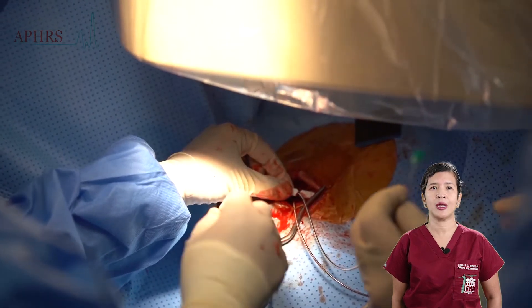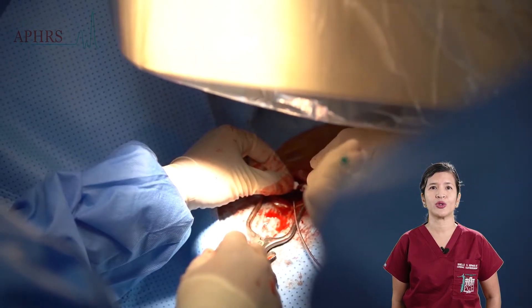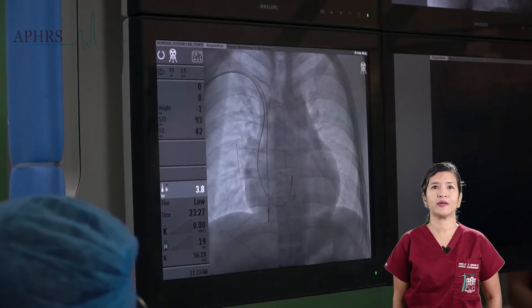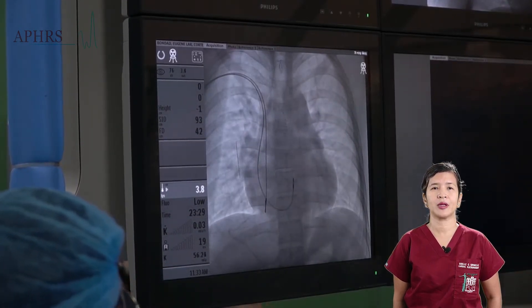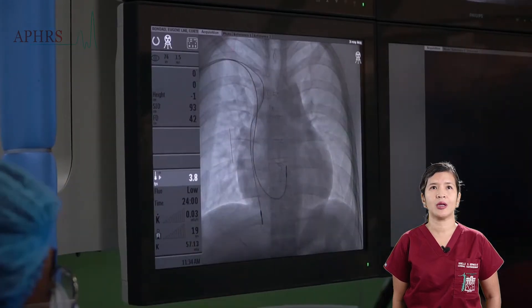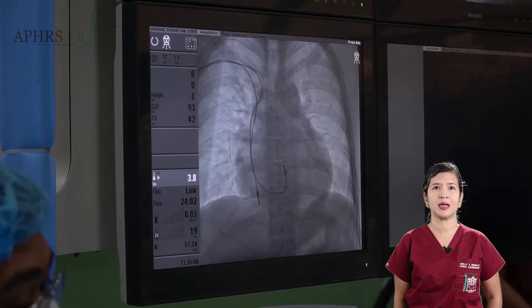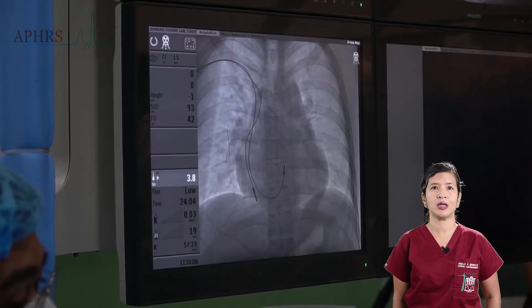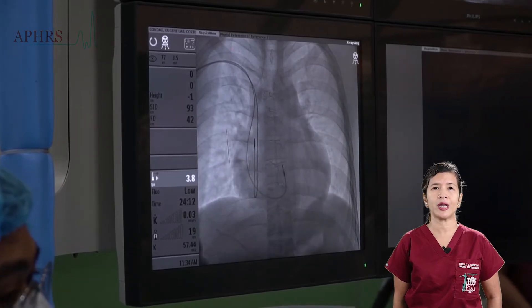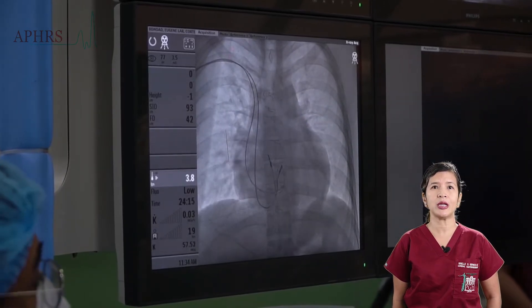Alternatively, a valve sheath may be used. The RA lead is positioned at the floor of the right atrium, and at this point the straight stylet is removed and the preformed J stylet is inserted into the RA lead while attempting to negotiate positioning at the area of the right atrial appendage.